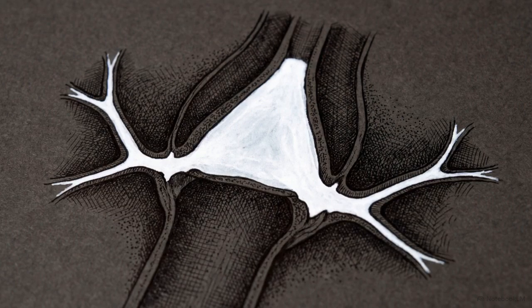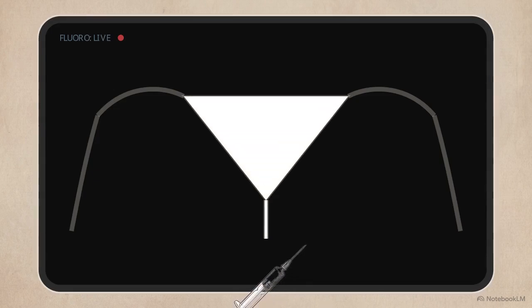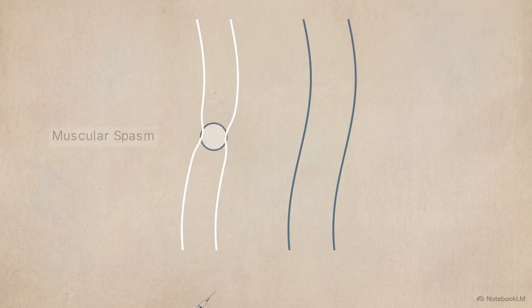This fluoroscopy image illustrates the mechanical diagnostic test. The operator seals the cervix and forces radiopaque fluid into the cavity under live X-ray to track exactly where the fluid successfully flows and exactly where it stops. Operators must carefully account for false positives. Trapped air bubbles or temporary muscular spasms in the tubes can mimic the appearance of a permanent physical obstruction.